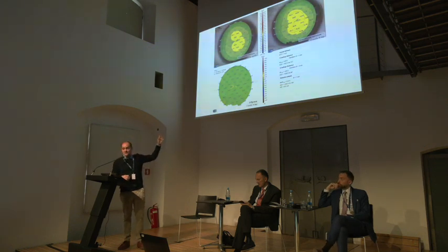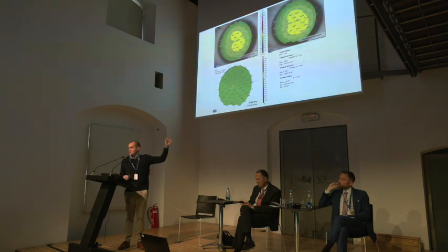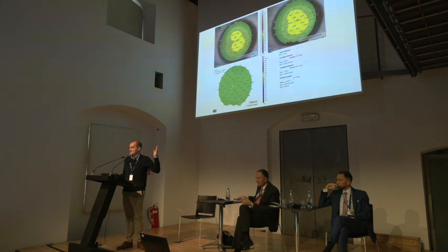Anyways, look, using the MS-39, we could make a conclusion that this eye is almost equal to itself a month ago. So 24 hours after surgery, we just did PRK without any other wait time because you could have reliable data points.